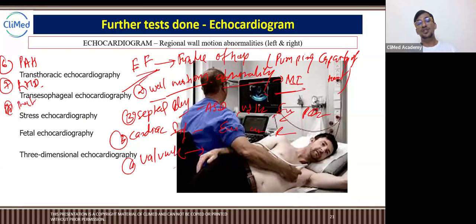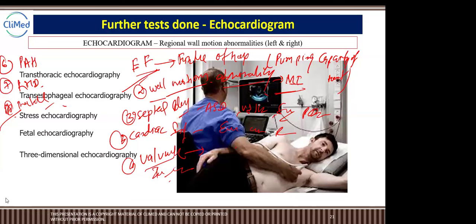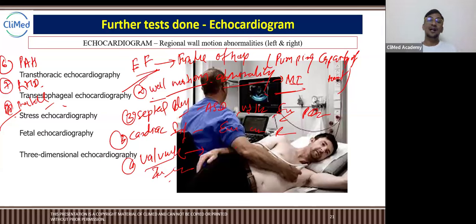Fetal problems can be checked by the echocardiogram, and many other things. We use echocardiogram to check all the heart functionalities, structural or non-structural, everything can be checked. Yes, vegetation, thrombosis, like when I'm talking about valvular heart disease, thrombosis, regurgitation, everything comes in this. Tricuspid valve, bicuspid valve. Okay, so all valve related problems come in the valvular heart disease, right?